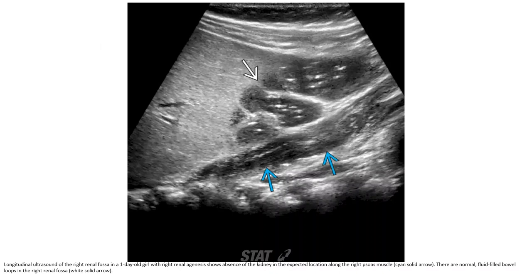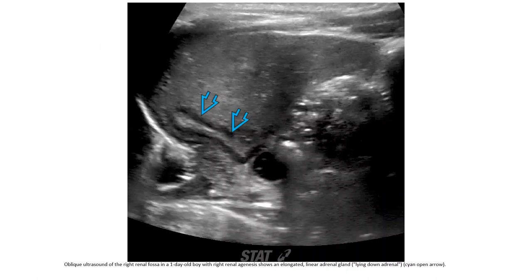This is the ultrasound of the right renal fossa in a one-day-old with right renal agenesis. There is absence of the kidney in the expected location along the right psoas muscle, with fluid-filled bowel loops seen in the right renal fossa. The oblique ultrasound of the right renal fossa shows an elongated linear right adrenal gland.